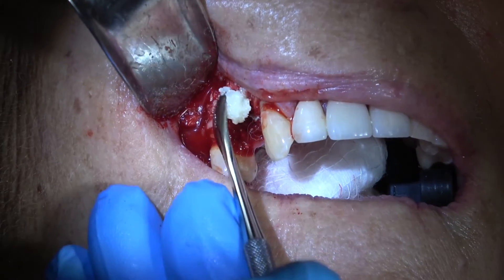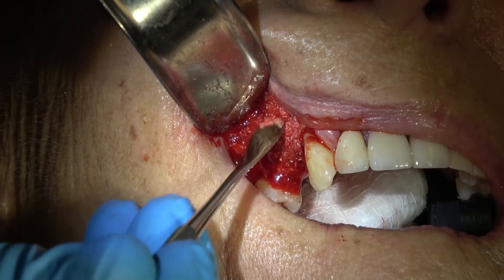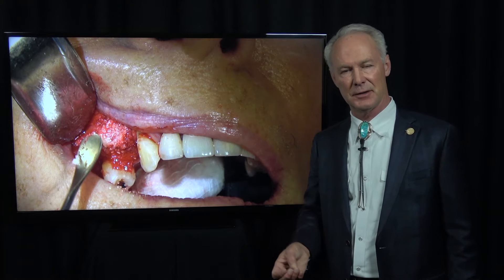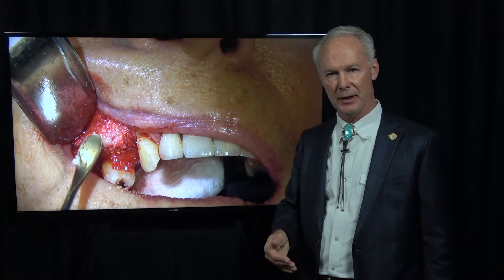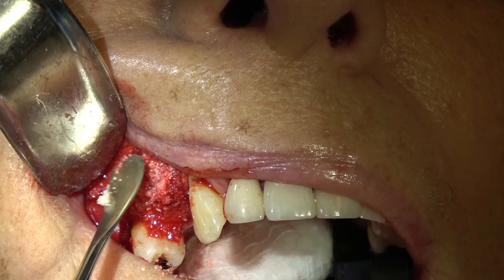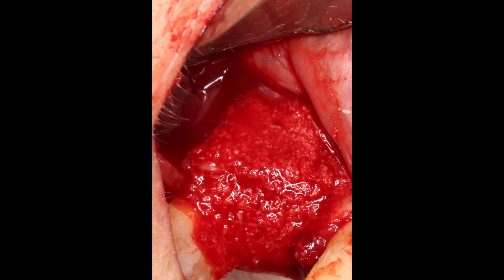In this case, we're using Maxius mineralized demineralized freeze-dried bone. Many times I'll place an implant at the time of extraction if it's a single-rooted tooth. If the bone is compromised, I won't do that — I'll bone graft it and wait six months to place the implant. Sometimes three months, but if we're not in a hurry I'd rather wait six months to be sure the bone has healed well and is nice and dense.